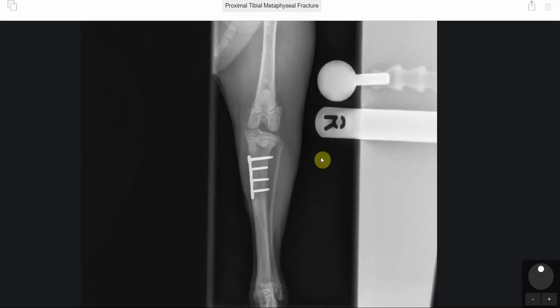On the caudocranial view, there was good healing of the fracture. However, what can be seen is there's mild curvature of the tibia — the distal tibia had moved out slightly. This being said, there was no impact on Stone the dog's recovery. Stone did really, really well.